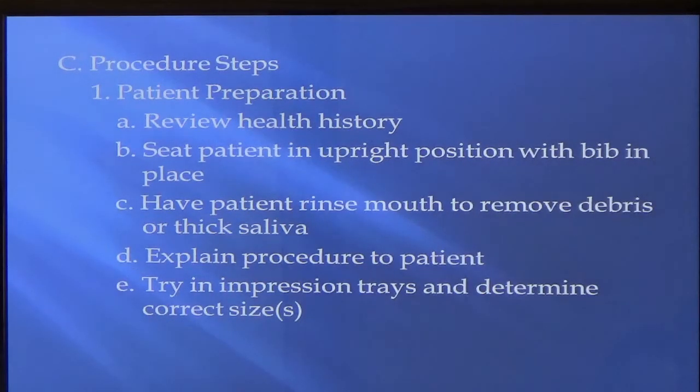The impression trays, okay, again, just like with any patient, you're going to review the medical history, make sure you have the patient in the upright position, sitting up. Don't have them tipping back when you're going to take an impression, because that doesn't work very well. Make sure that you don't have any debris, because if they've got stuff stuck in their teeth, that stuff is going to be on the impression. So if we worked on the patient before we take the impression, make sure they've rinsed out and don't have anything else stuck. Make sure you tell the patient what you're going to do.